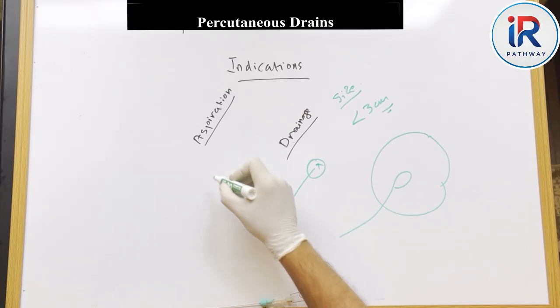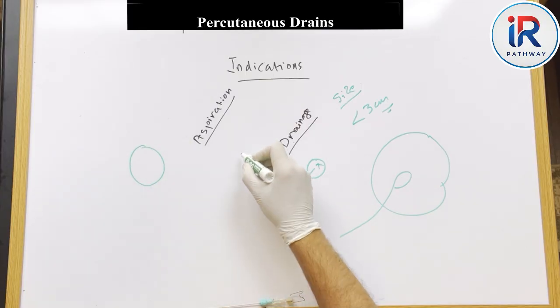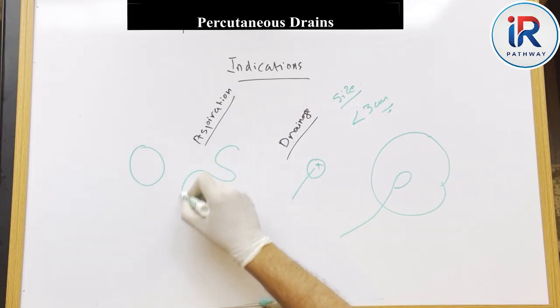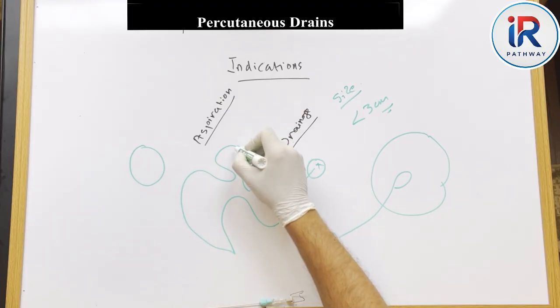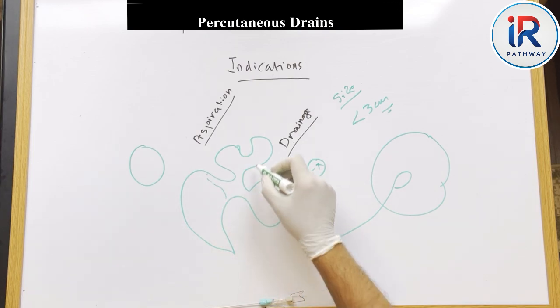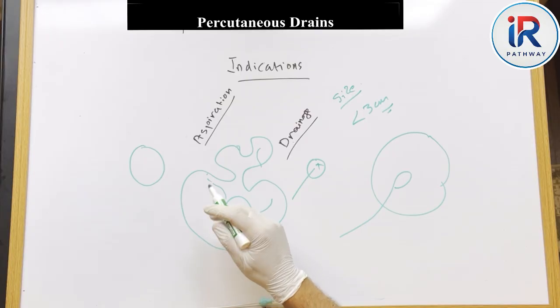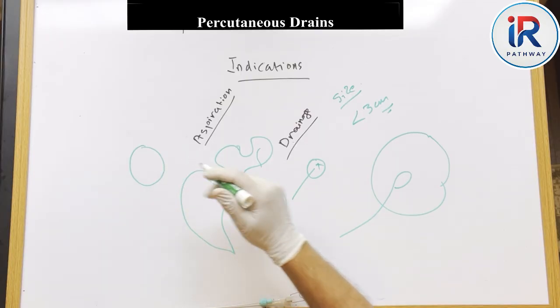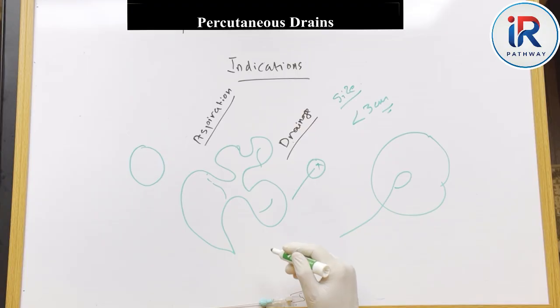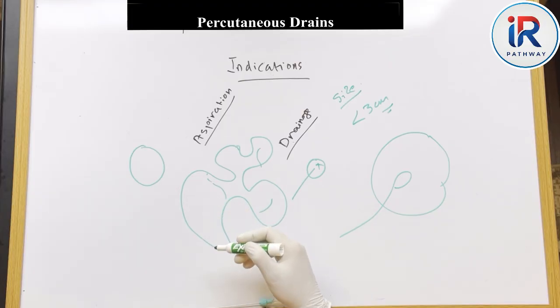The second factor is the nature of the collection. Simple collections can be aspirated, but multiloculated ones may look single on imaging, yet contain partial septations that may only be seen on ultrasound. So aspiration drains only the first pocket, while the others need time and continuous drainage because they might be connected through very small openings.